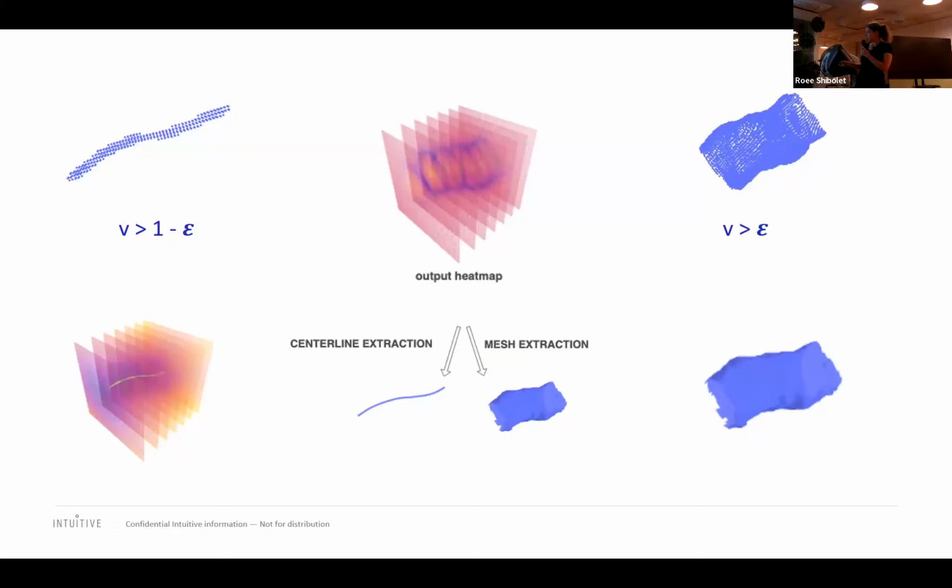And for the mesh extraction, we used a very well-known algorithm called marching cubes, that basically extracts a mesh from this kind of 3D matrix where the position of the surface is equal to 0. We need to modify it a little bit, but basically we use marching cubes. And so that's our algorithm. Now I'm going to show you a few results.